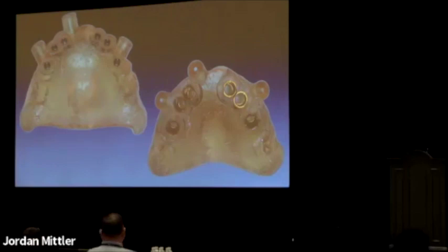We can then convert these into surgical guides. I'm a really big fan of the Versa surgical guided system. I don't know if any of you are familiar with that, but the Versa burrs are designed for bone osteodensification. They actually run in reverse. And they're great, especially when you have thin, not great bone. As you can imagine, her bone was not great.